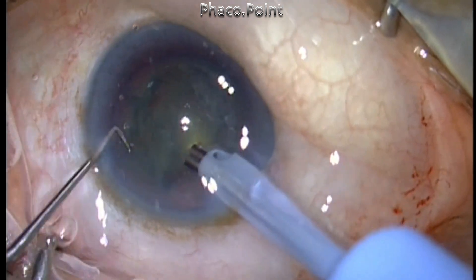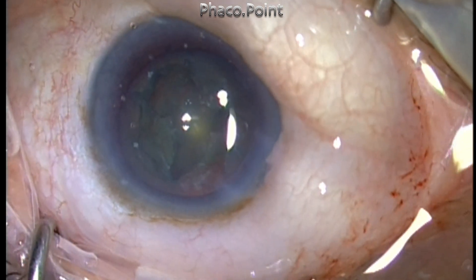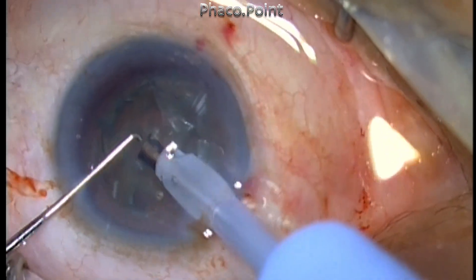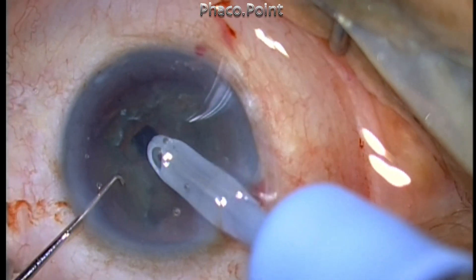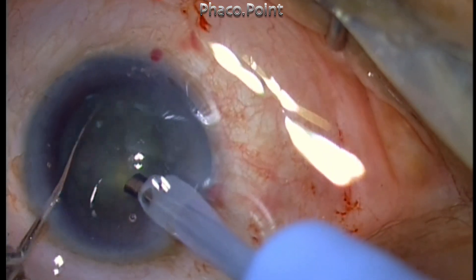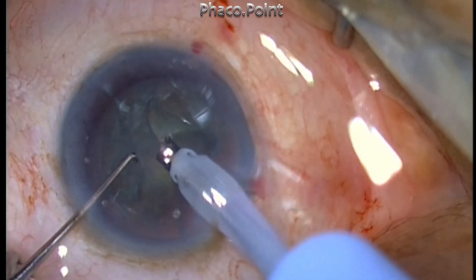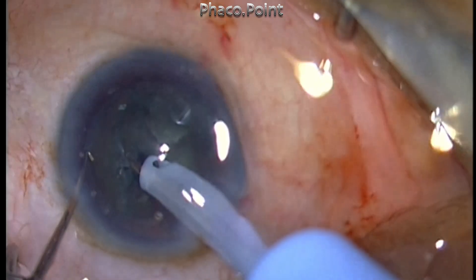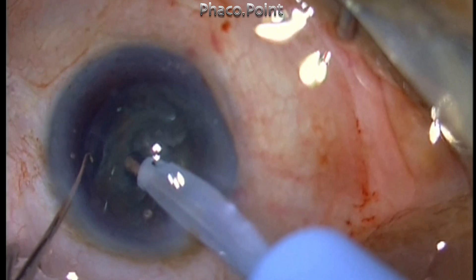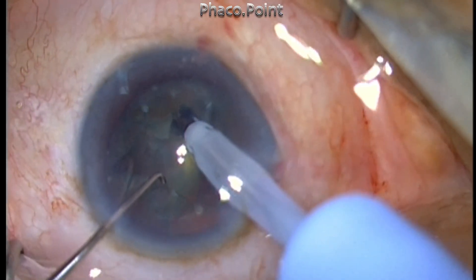This continued till I ended up eating up small chunks and small pieces of the soft gummy cataract and eventually ended up with a crater formation. This goes to show that soft cataracts will prove to be a challenge even in the most experienced of hands under certain circumstances.